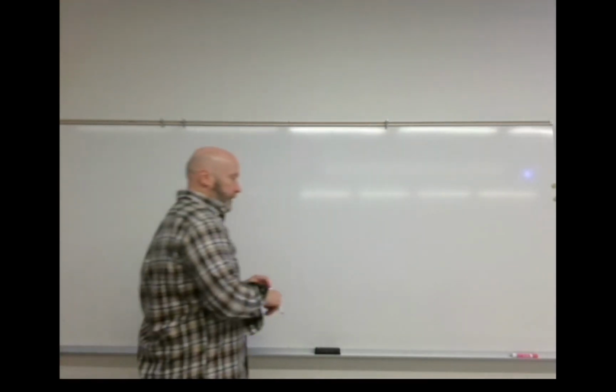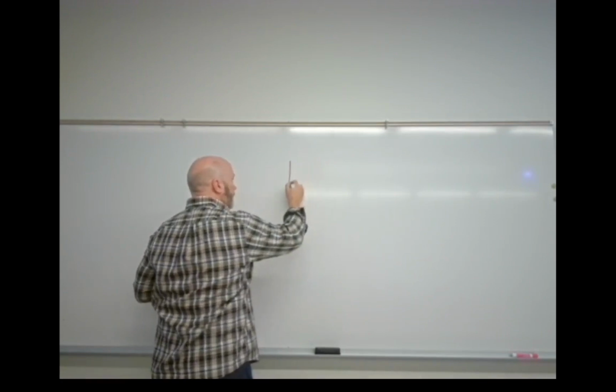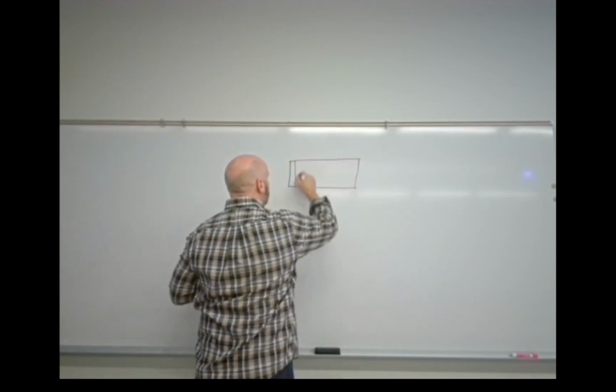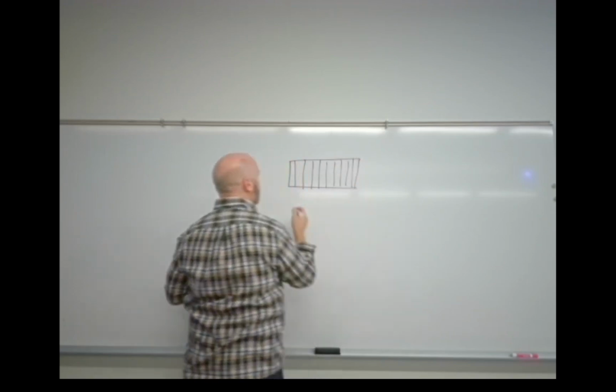Yeah, there's math for this. Not a ton of math, but there is some math. All right, so let's say we have a grid, and I'll kind of draw it out. So we've got a grid and we've got these grid strips. This is a little bit of a warped grid with floating grid strips.